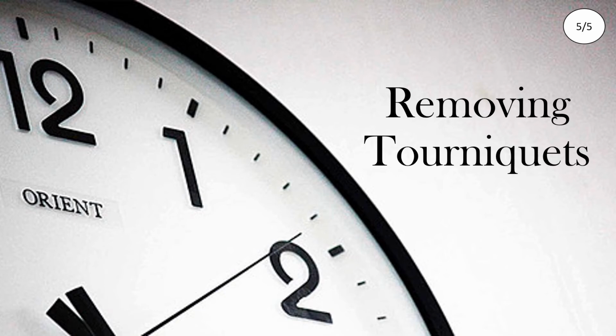It is so easy to get caught up in the excitement of inserting an IV that you leave the tourniquet on and walk out of the room. Talk with your patient beforehand and tell them you will remove the tourniquet quickly. This will involve your patient in the care and process and also create a backup reminder if you should forget. Remember, no more than 2 minutes.